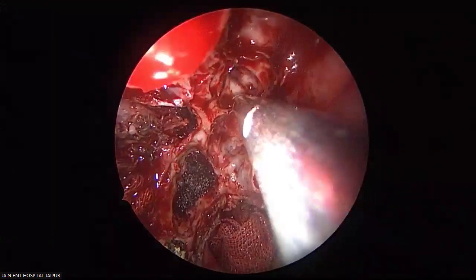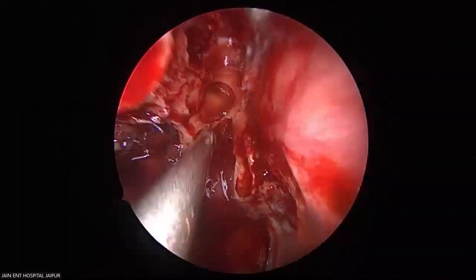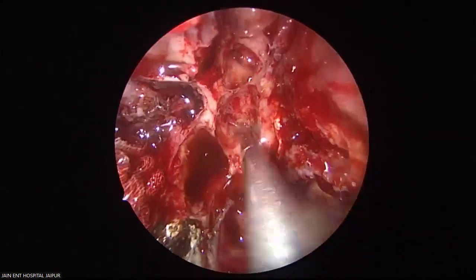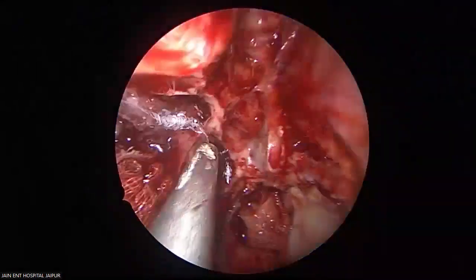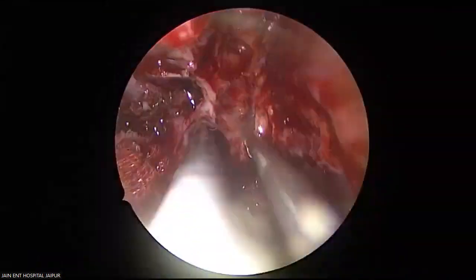This is again for your information. That is Onodi, see above. This is the sphenoid sinus. This is your pterygoid complex. See my Surgicel in the superior orbital fissure.